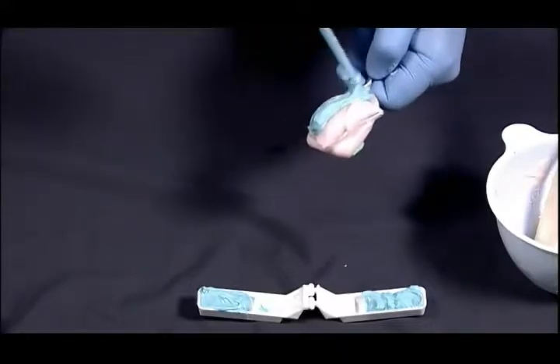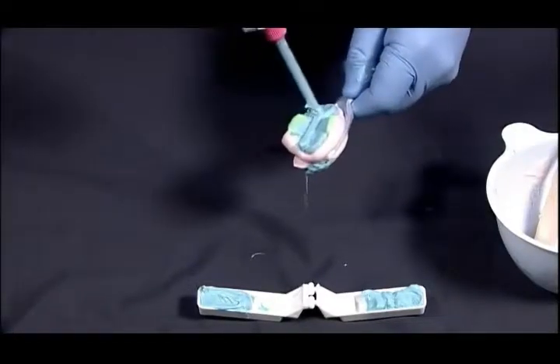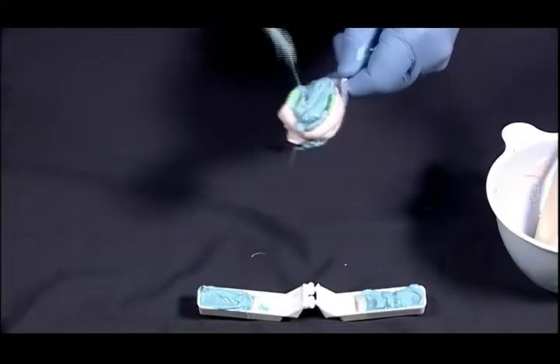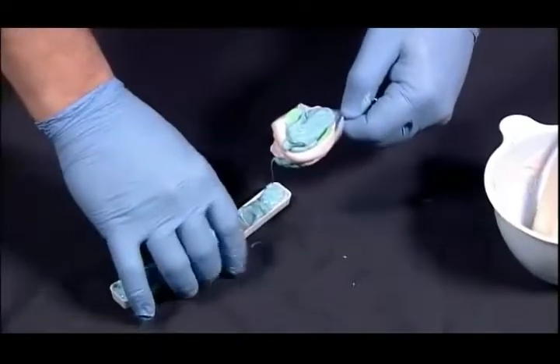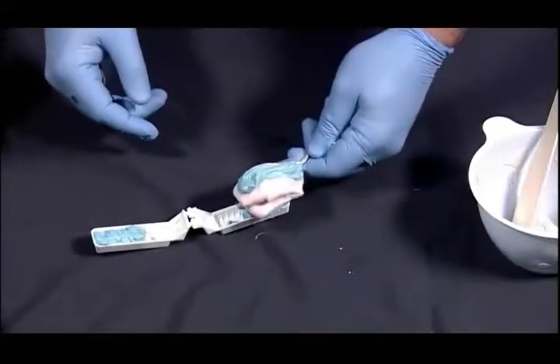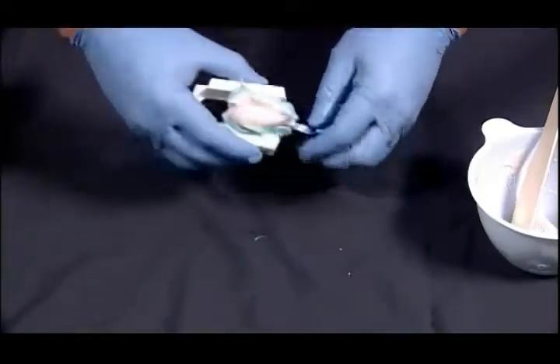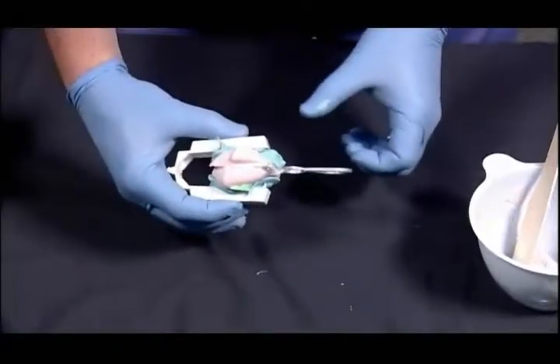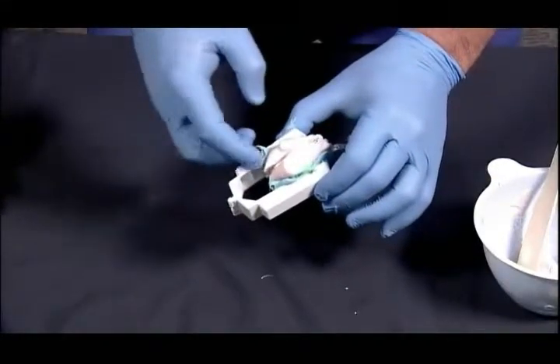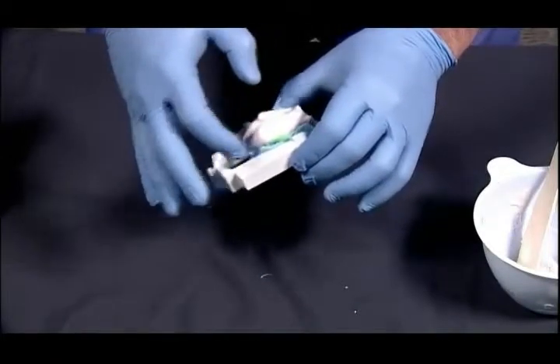And I want to make sure I have fresh material when I mate everything together. So I'm going to go back to the first side and add some of this fresh material because it does set very, very rapidly. And your assistant at this point is making this model. You're using the side without the septums as the side that is utilized for the dies, and this is the articulation side. Now you'll see that we have the model articulated. This material will set up very rapidly. I'm going to actually do this live, real time, to show you how fast this really goes.